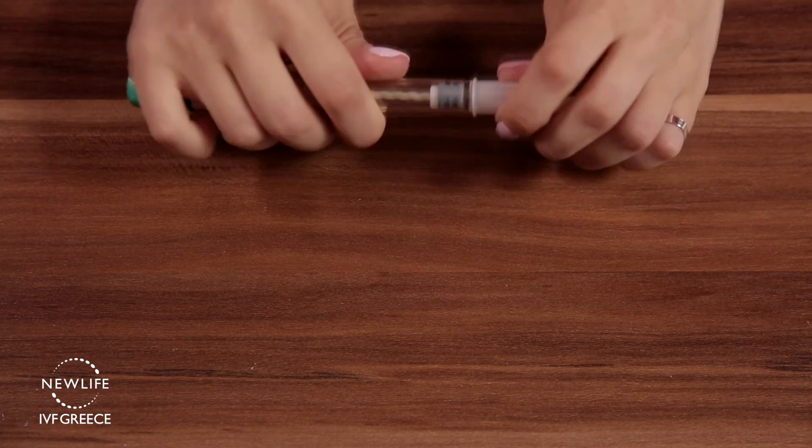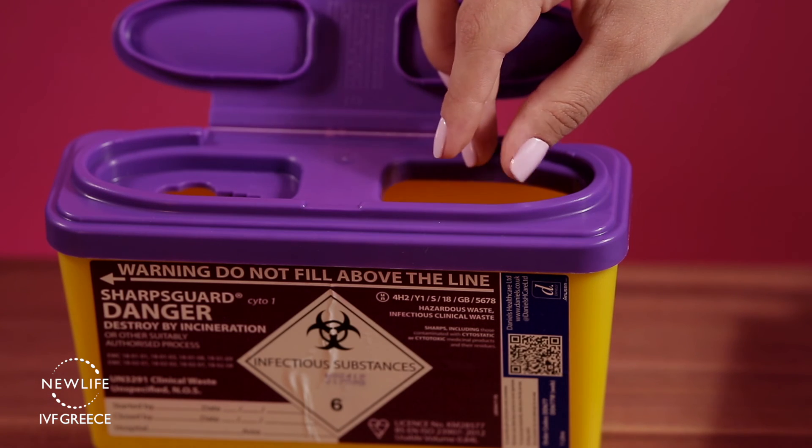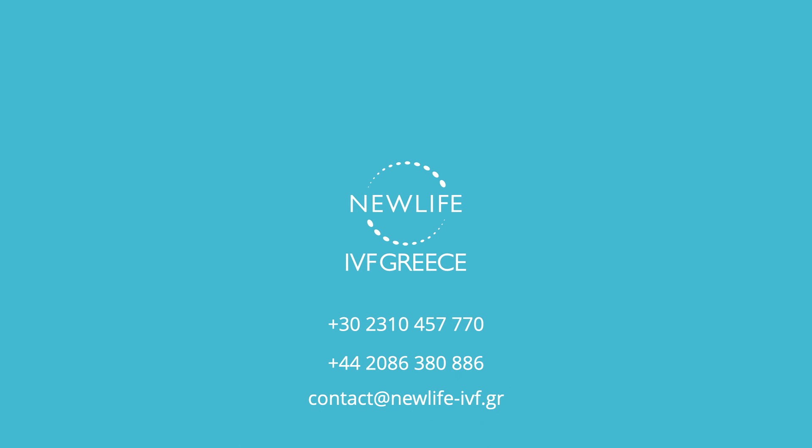Recap the pen. Dispose of the needles in a suitable container or bring them to the nearest medical facility where they can dispose of them for you. If you have any further questions, please feel free to contact our IVF unit.